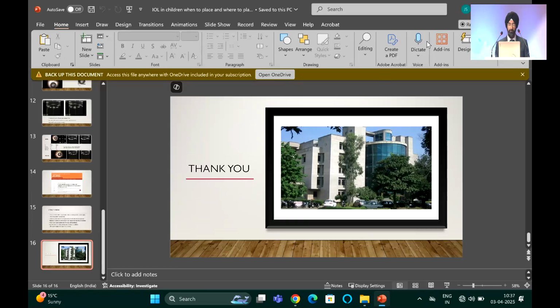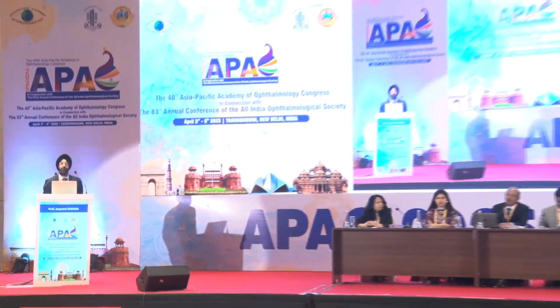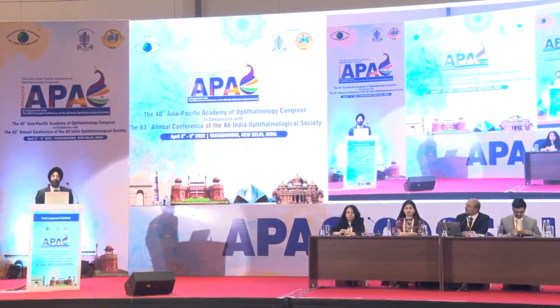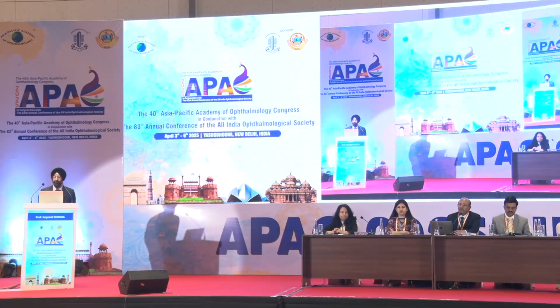Thank you, Dr. Jaspreet, for the excellent presentation. And you have told us something new, particularly the UBM and capsular bag size. Because till now we used to say what is the axial length of the globe, what is the corneal diameter, and this is something new also, because many of the people are not considering the capsular bag size while implanting IOL.